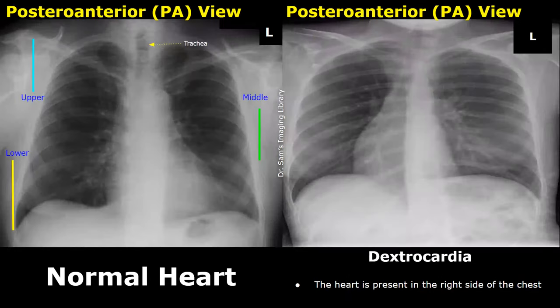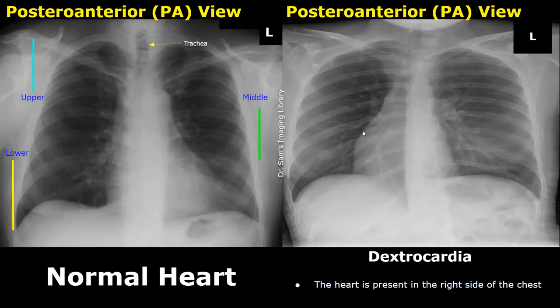Dextrocardia is a rare condition in which the heart is present on the right side of the chest. It can be easily seen on an X-ray when proper image processing is done. The apex of the heart is towards the right side, so we can see the heart is present in the right side of the chest in this image.